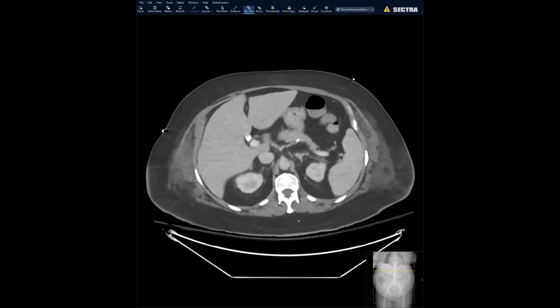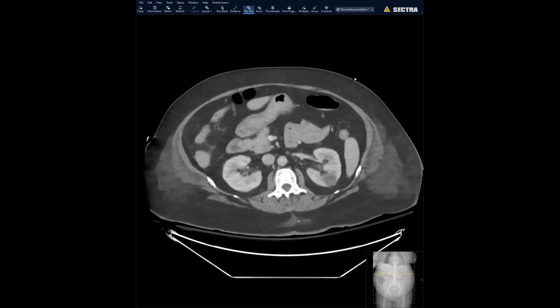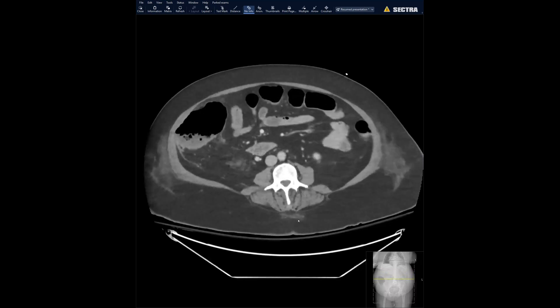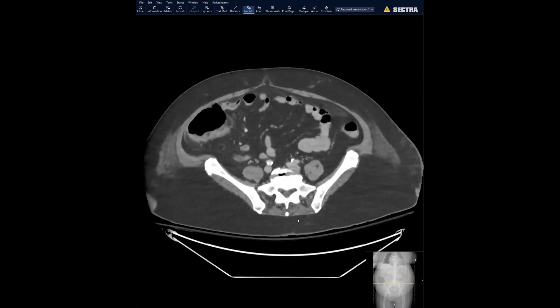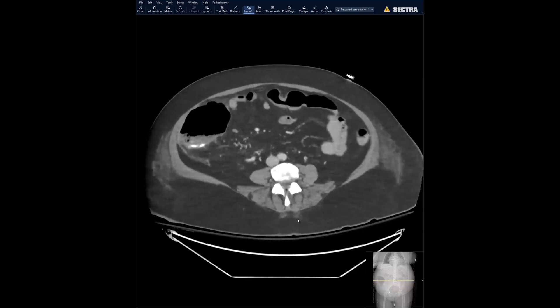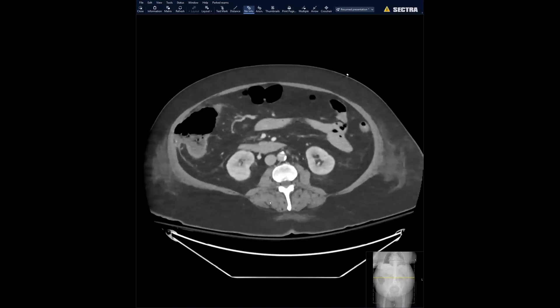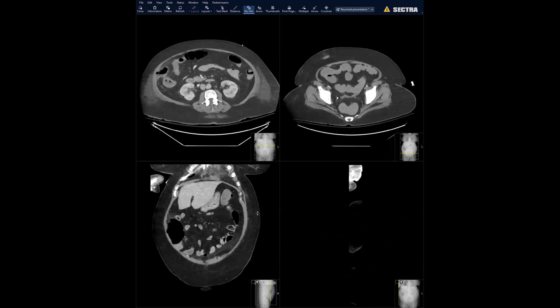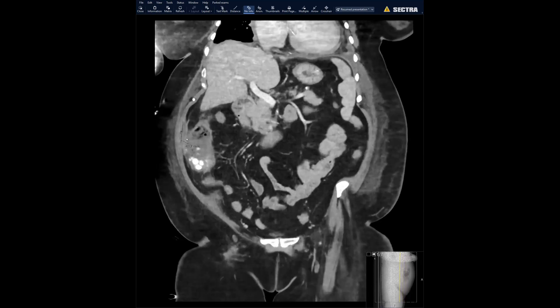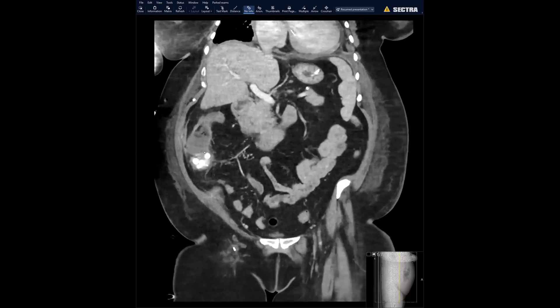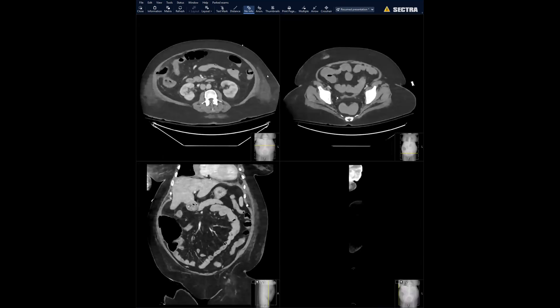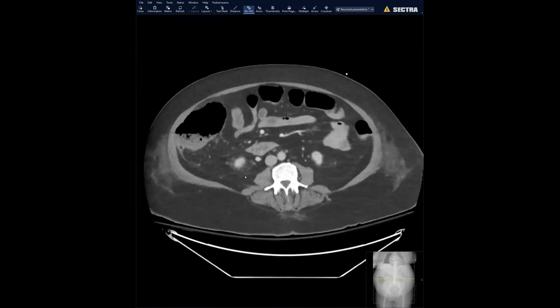I'm showing the venous phase — I'll come back and show the arterial — but there was no real GI bleed. There was one other significant finding. Very nicely seen on coronals: there's the wall of the colon, and then suddenly we see it decompressed into the abdominal wall with air outside the lumen of the colon. This actually ended up being ischemic cecum and ascending colon.